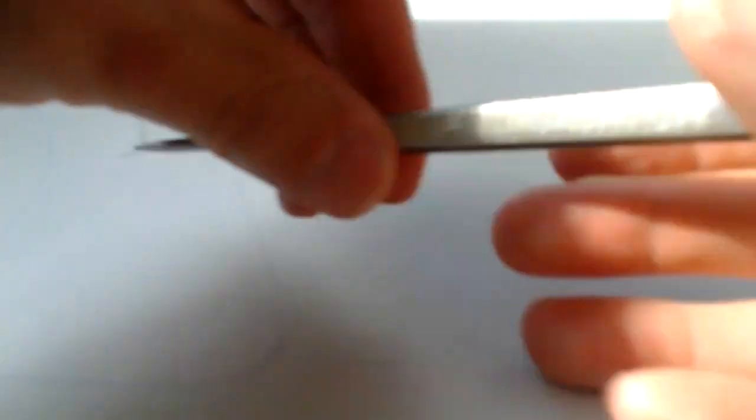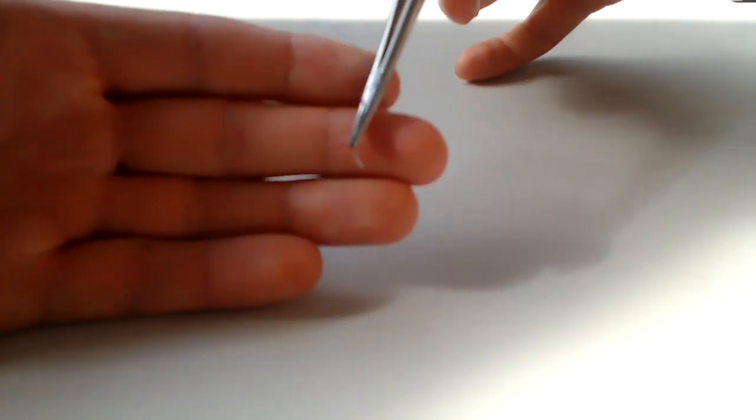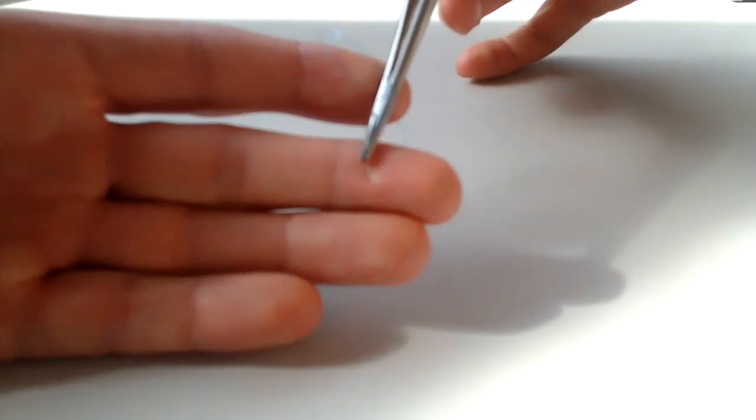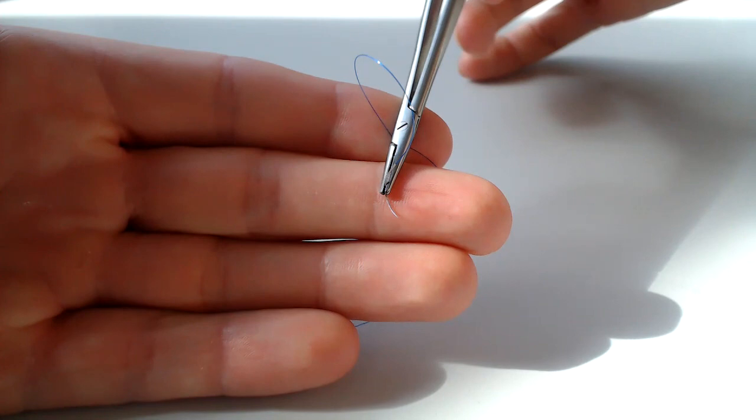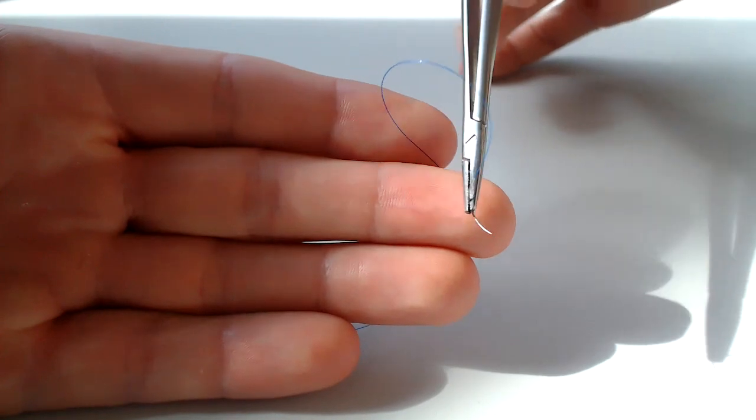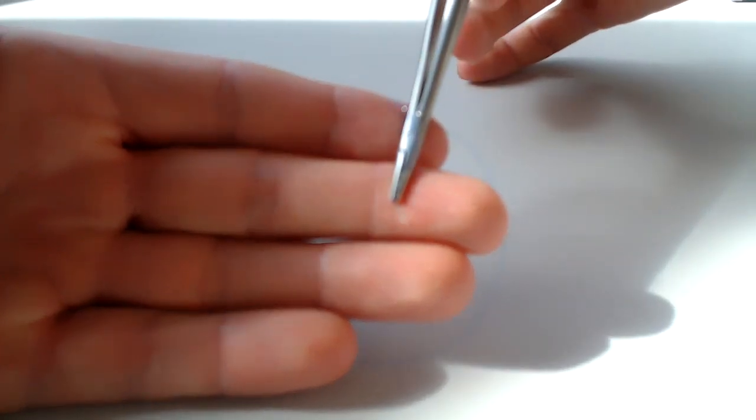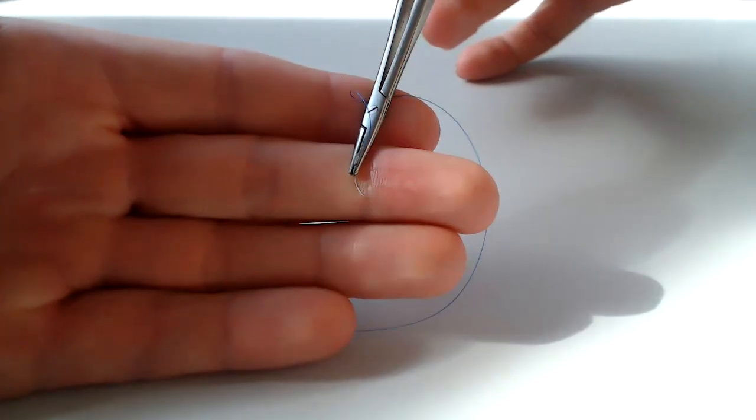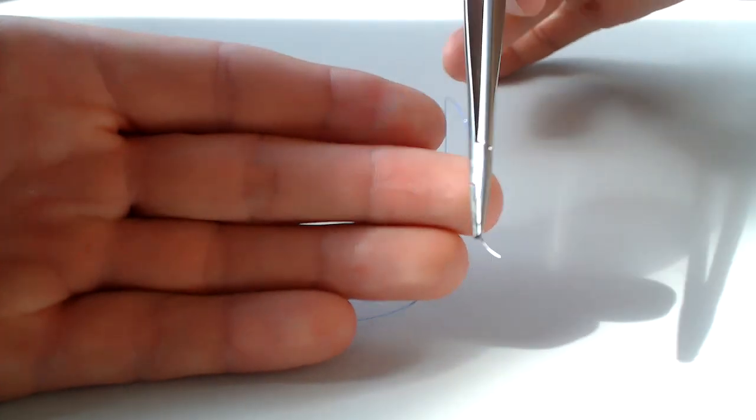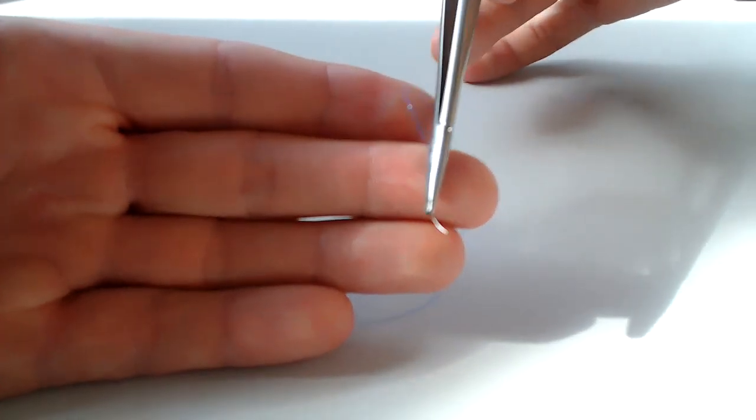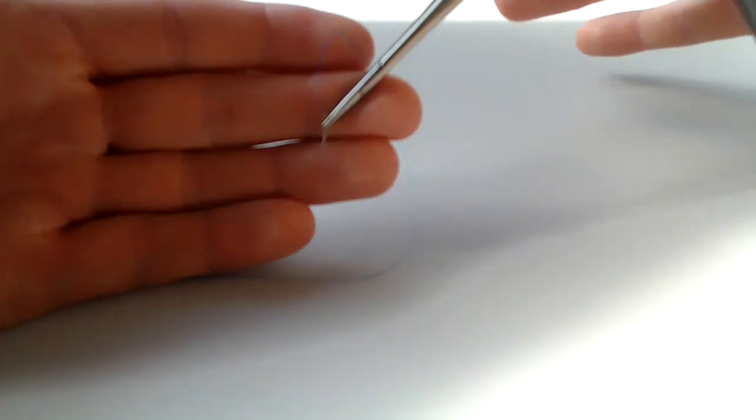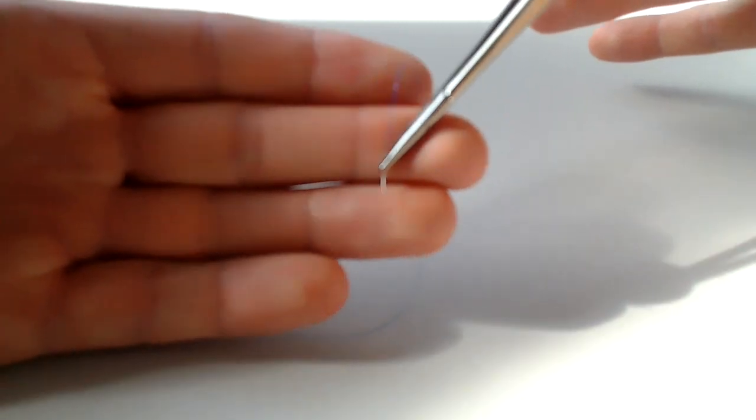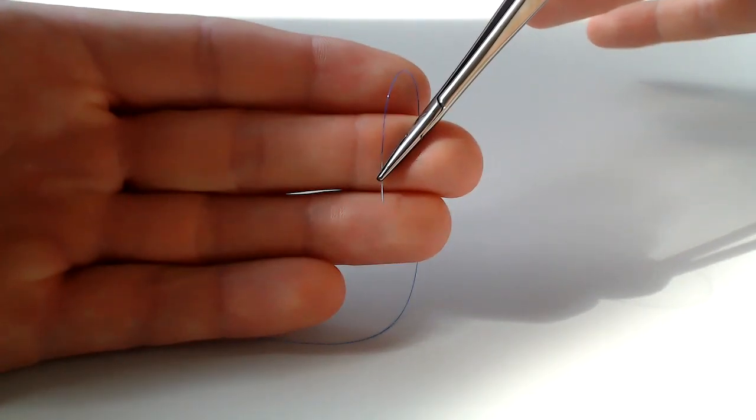That's not going to help you. Even when you're sewing in the back corner towards you, well, what you should be doing is a forward angle. And then what you do is you're putting your wrist out. I'm kind of putting it away from me. And then I'm driving the needle. You can see that it's driving towards my right elbow. I'm right-handed. This puts the needle in a direction where I can drive it towards my right elbow.